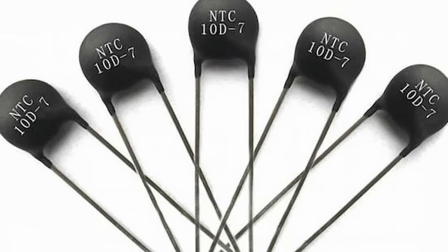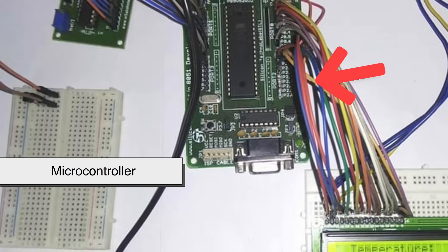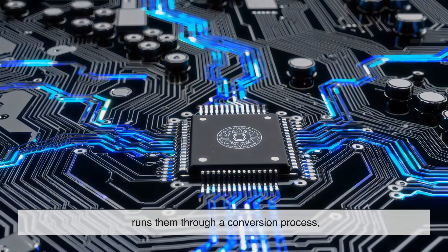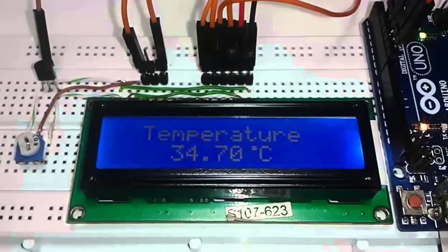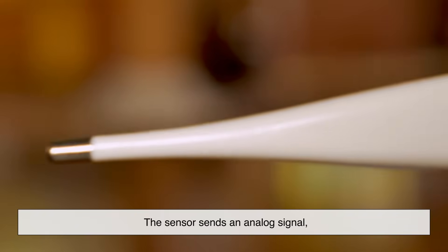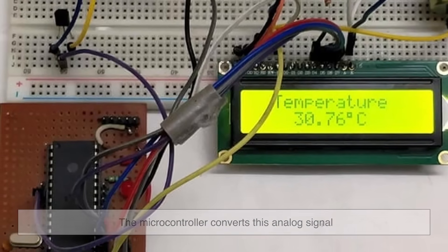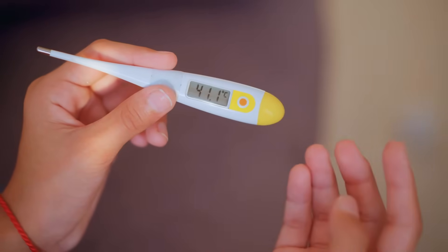So the thermistor senses the temperature, but how does that become a number you can read? That's where the thermometer's microcontroller comes in. The microcontroller is like the brain of the thermometer. It takes the electrical signals from the thermistor, runs them through a conversion process, and translates them into a temperature value. This process involves something called analog-to-digital conversion. The sensor sends an analog signal — a continuous electrical voltage that varies with temperature — and the microcontroller converts this into a digital number that can be displayed on the screen. Within seconds, you see your body temperature on the thermometer's display.